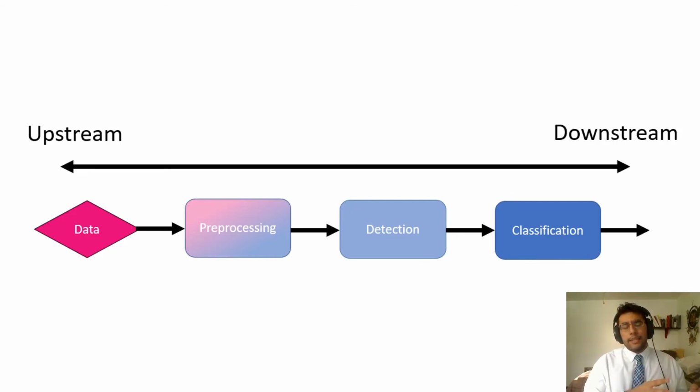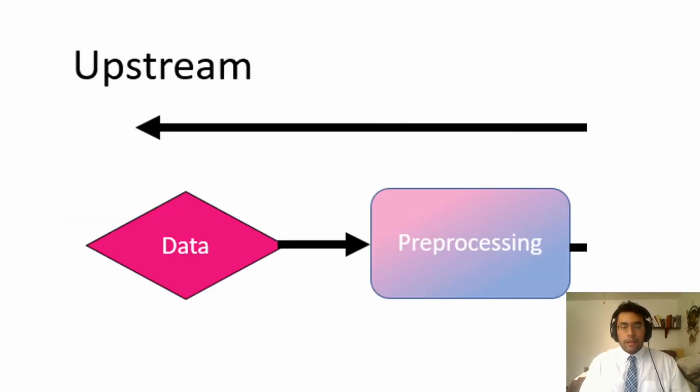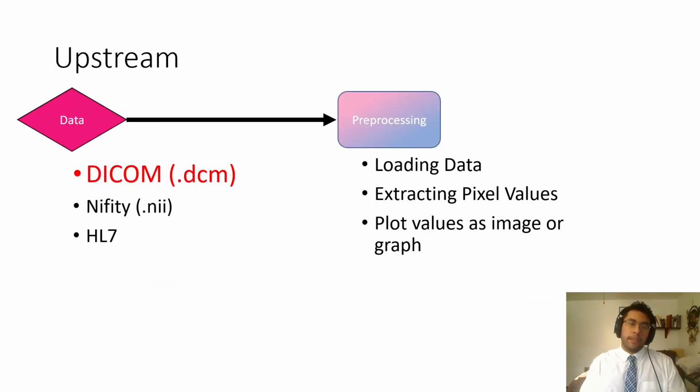We're passing this data through several programming functions that cut the size of the data down, looking at data that is only apparent to the disease case. So how well detection and classification of a disease happens downstream is really affected by the upstream process, especially in this pre-processing area. So for this lecture, we're only focusing on data and pre-processing.